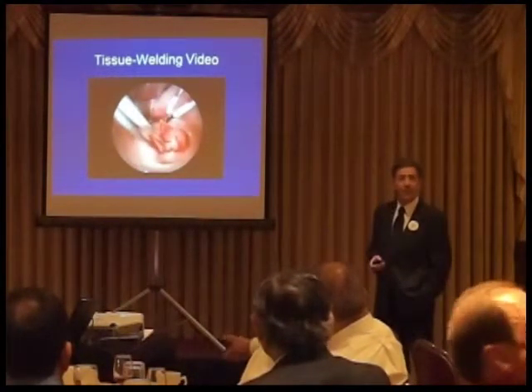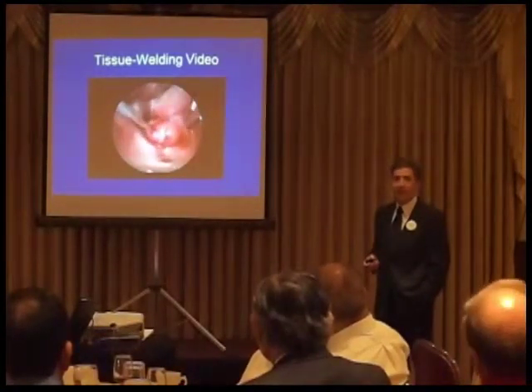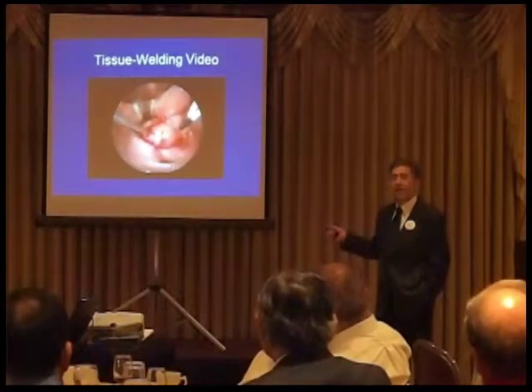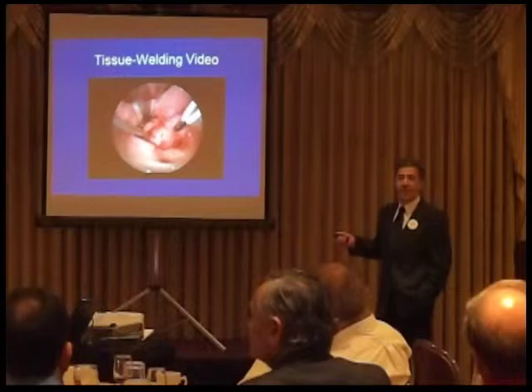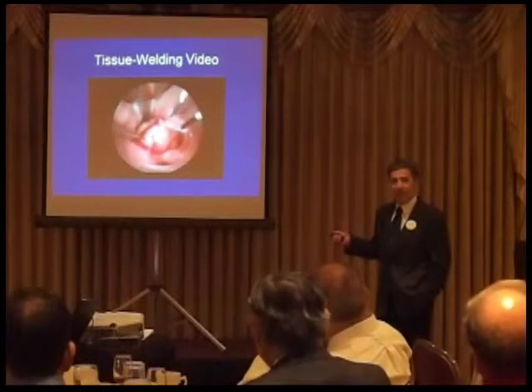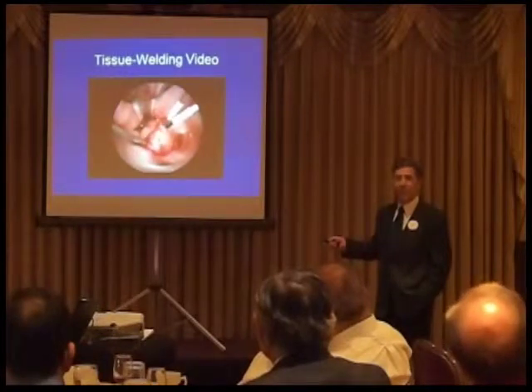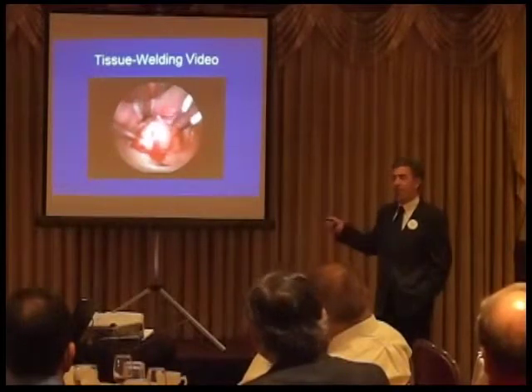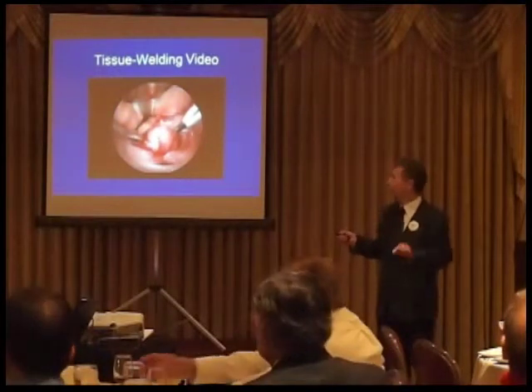So, Chuck, is this like a bipolar technique, though? I would call it a bipolar technique because I just pinch and cut and pinch and cut and pinch and cut. But it's called tissue welding because there's no electric current that goes through it. And actually, I think this is also interesting for things like thyroid surgery. If you want to monitor the nerve, it's always been a freaky thing because the one moment that you want to see whether the nerve is being irritated is the one moment that the electricity is going to the body and the EMG cannot pick it up. I've done a couple of projects with this. It's very nice because your monitor is totally intact because it's just heat. There's no current going to the patient.